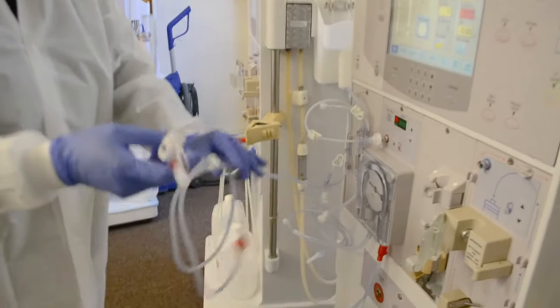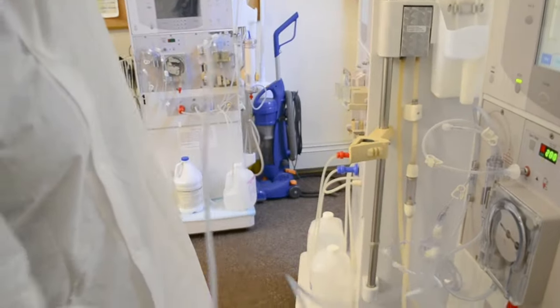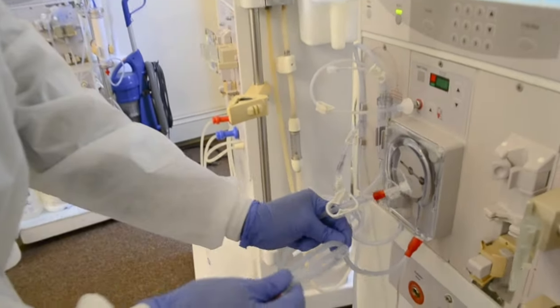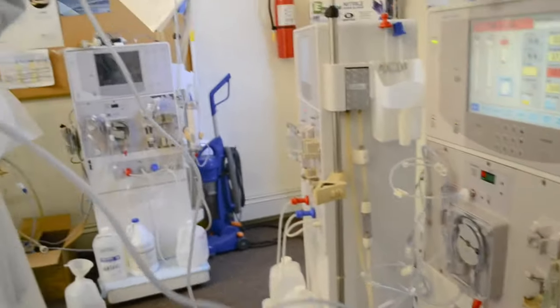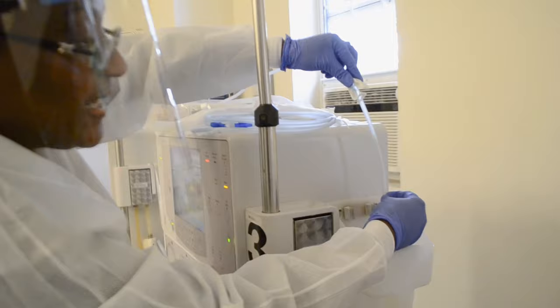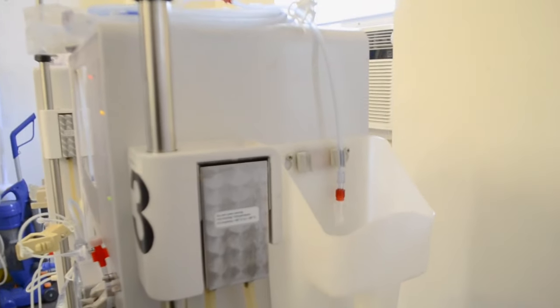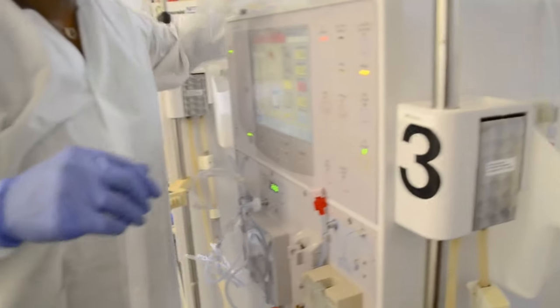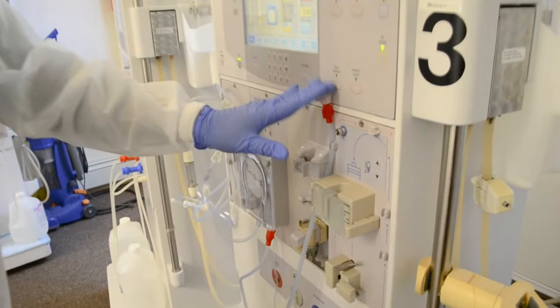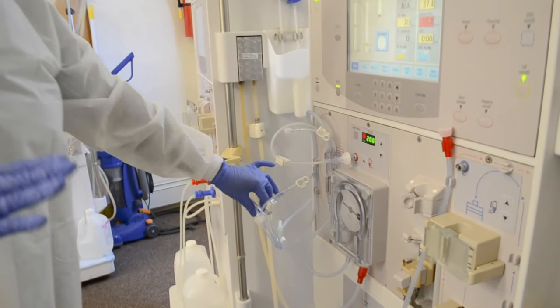I remove the tape from this part, and I'm also going to remove the tape from this part because I need to show you that there are two ends to this arterial line. I'm going to slide this white clamp back, and I'm going to attach this line to these hooks in the bucket. I have finished with my arterial bloodline, except the part going on the dialyzer. Remember, your saline T-line — we're going to do something with that also.